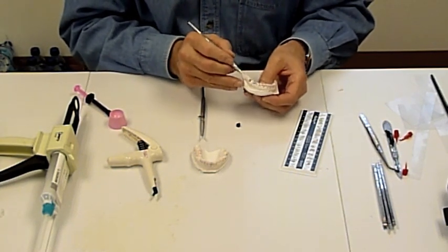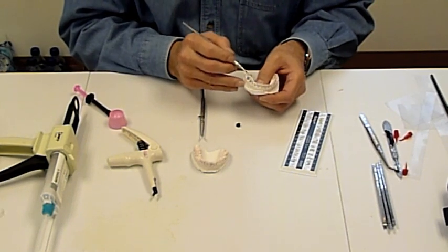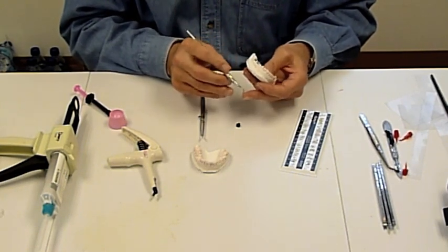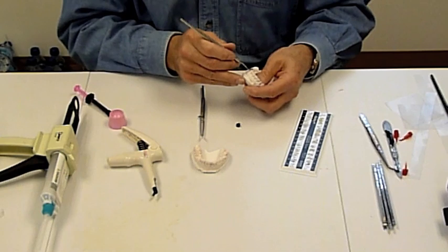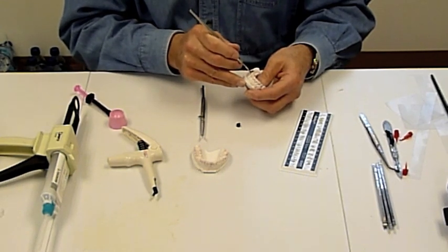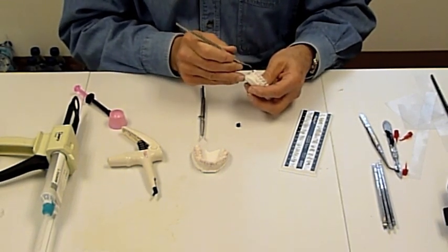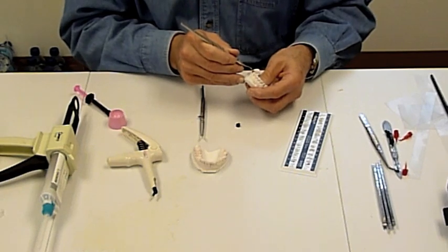A small amount of material. Remove the flash and position the bracket relative to the markings on the tooth.